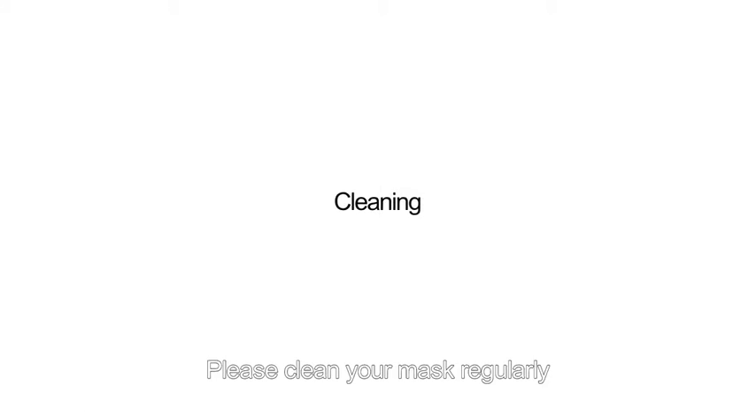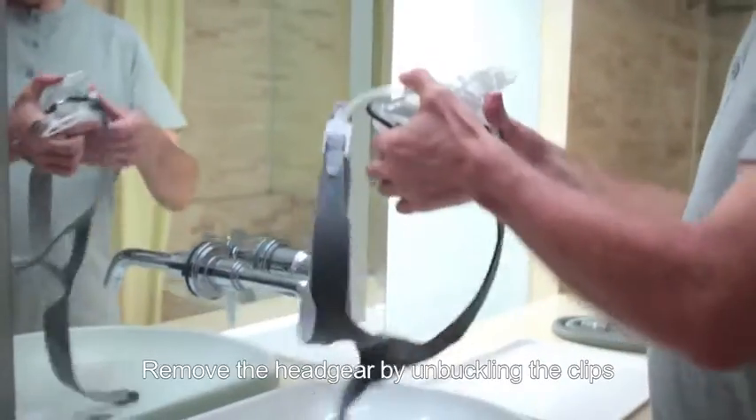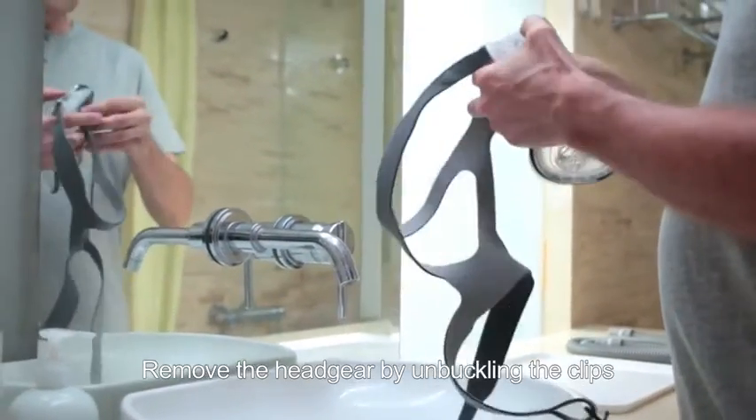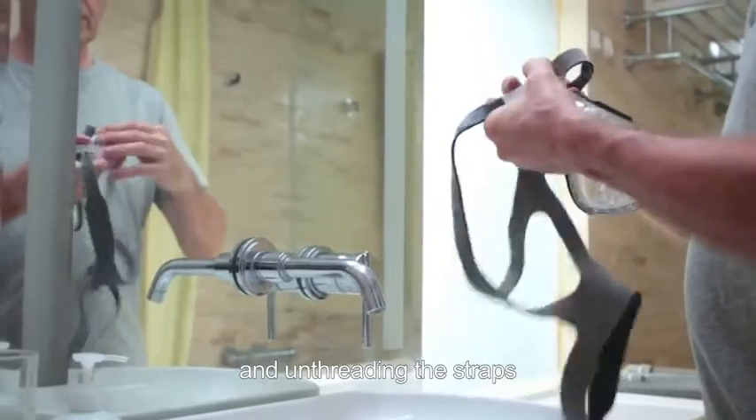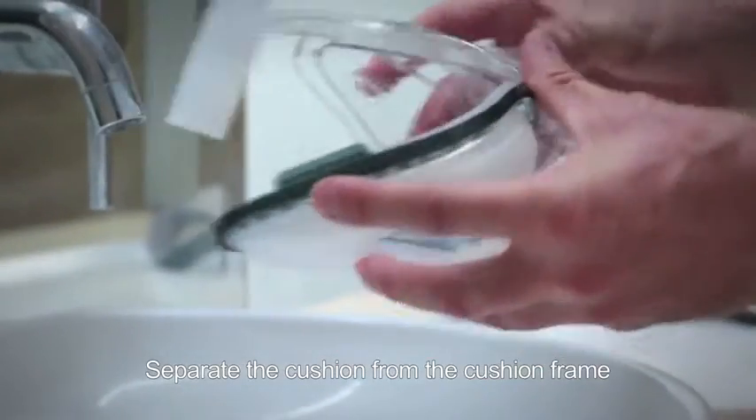Please clean your mask regularly. Remove the headgear by unbuckling the clips and unthreading the straps. Separate the cushion from the cushion frame.